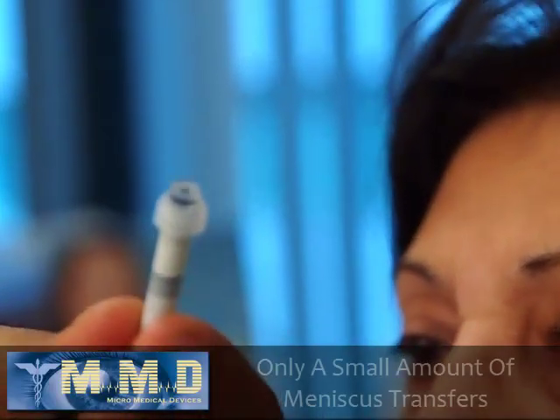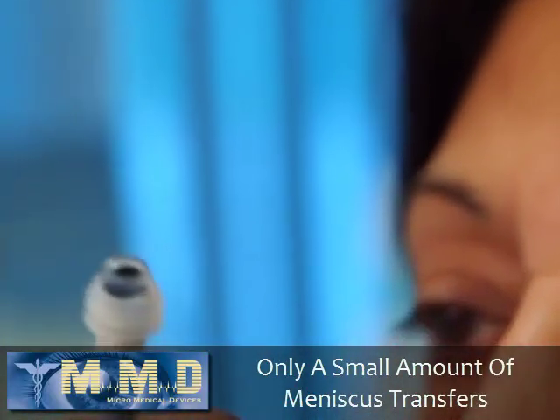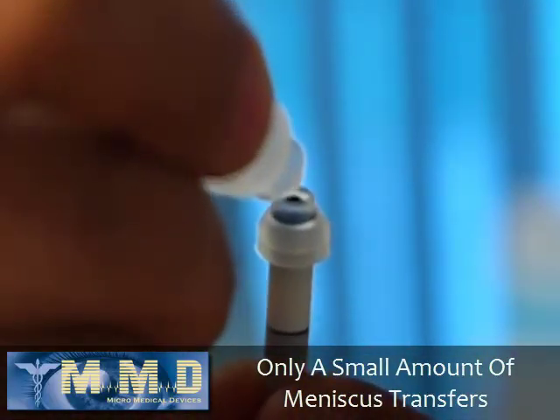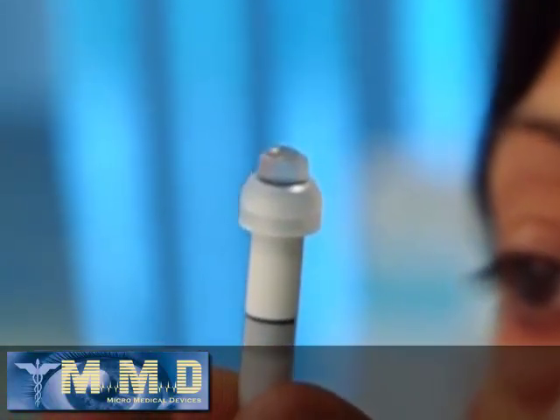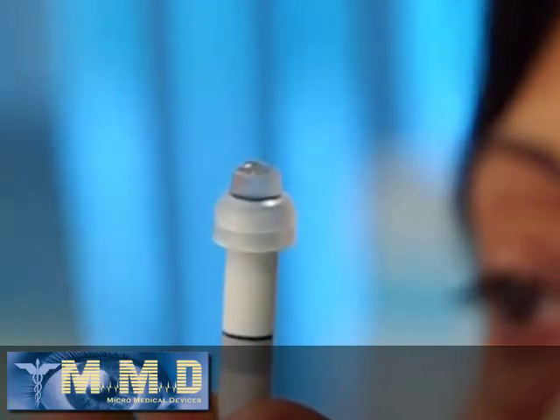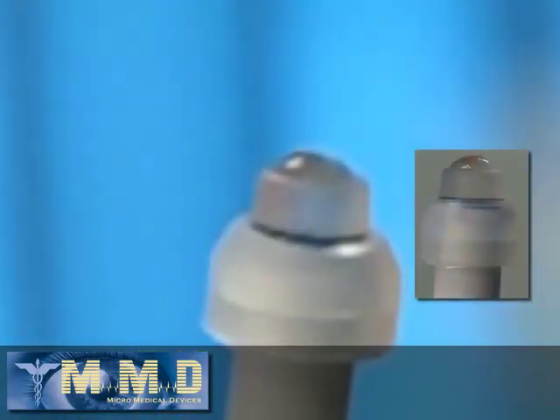Now that we have successfully scanned the right eye, we're going to scan the left eye. As you can see, only a very small amount of the meniscus on top was transferred to the eye. I put half a drop more to form the meniscus again. I like to zoom in right on top of the meniscus so you can see this is the perfect amount.